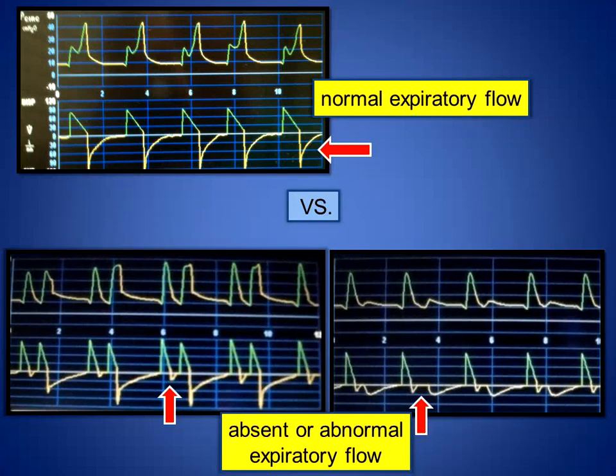And here's what I want you to think about, because what you'll often see is a decrease in airway pressure, but not understand, is it on the front or the back? And if it is a cycle asynchrony, the problem is transitioning from inspiration to exhalation. And if that is the case, your expiratory flow will always be affected. And so, again, if you want to know what's happening, look at the expiratory flow.